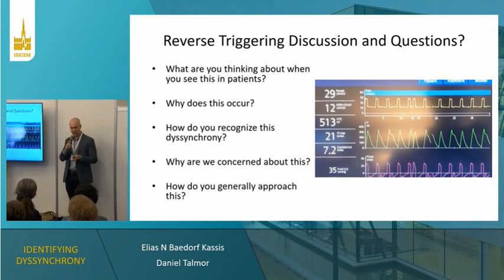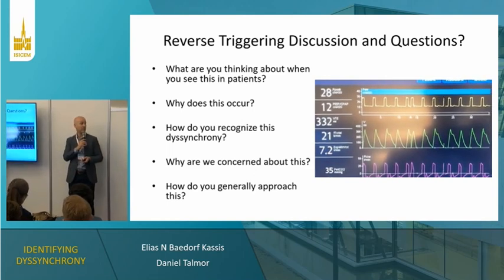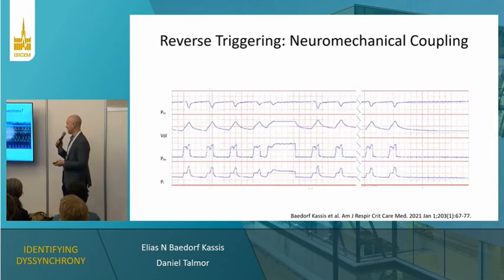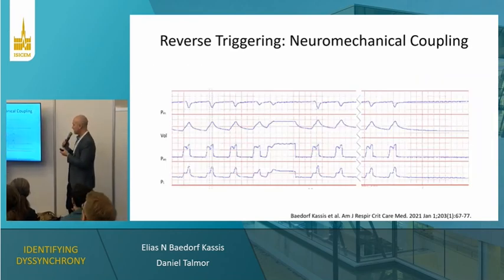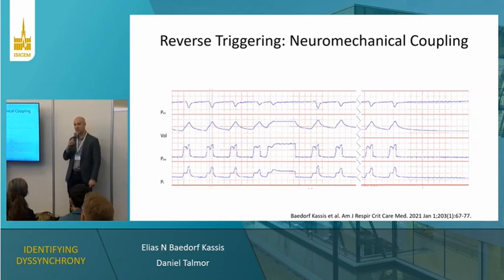And so we'll talk about next a little bit of how do we actually identify at the bedside reverse triggering when there's no actual breath stacking events, because this can be a little more challenging. Okay, and so first, what is reverse triggering? There's probably multiple different forms of it.